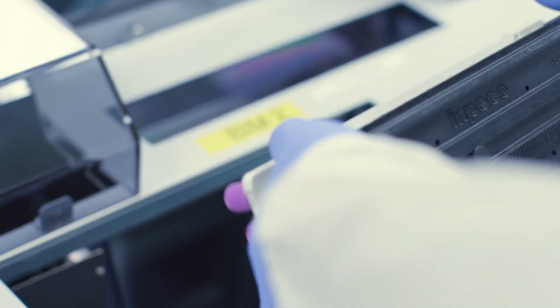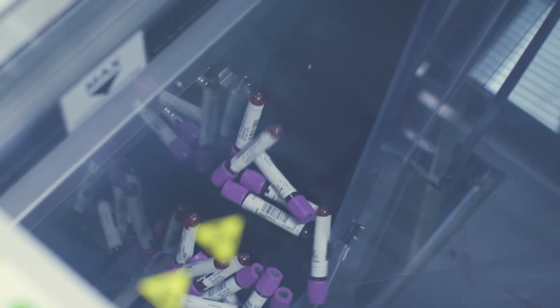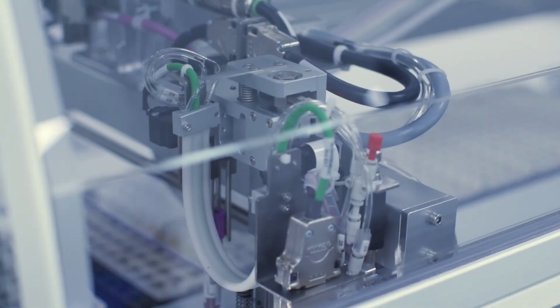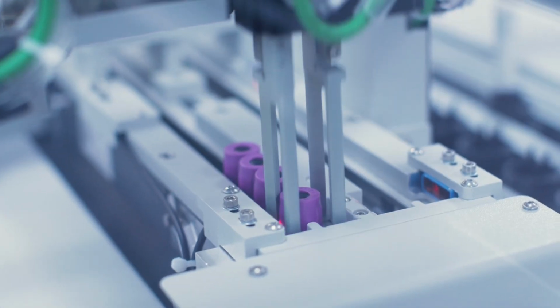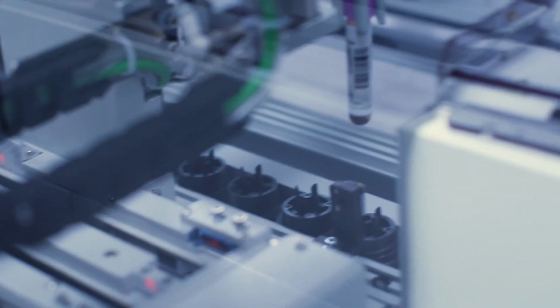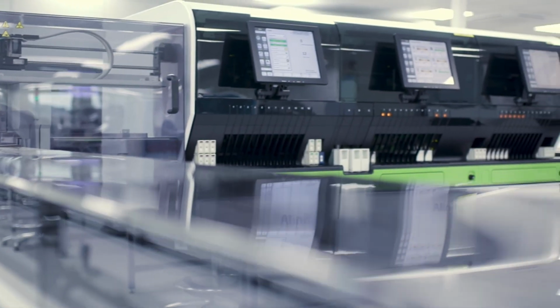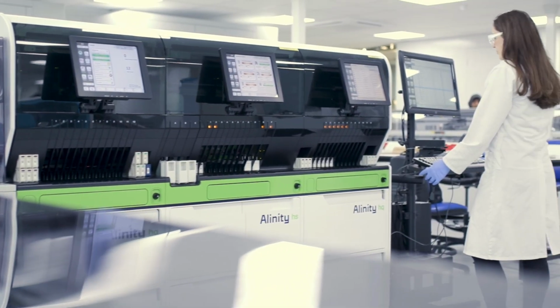One of the ways automation has improved our laboratory processes is, for example, the bulk input module on the track, which is a big bucket where samples are just loaded straight into, and the track will triage these samples for us instead of us having to batch them up in advance like traditional methods. I'd say that one of the biggest challenges I have right now is cross-training staff between chemistry and hematology.